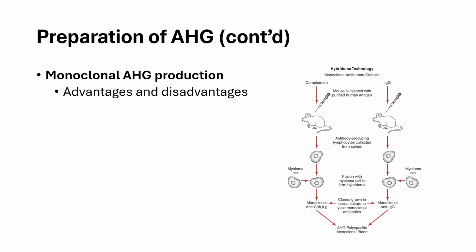It could lack reactivity with some antigen variants due to narrow specificity, and it has limited sensitivity compared to polyclonal antibodies in detecting multiple epitopes, and it also requires advanced technical expertise and facilities.